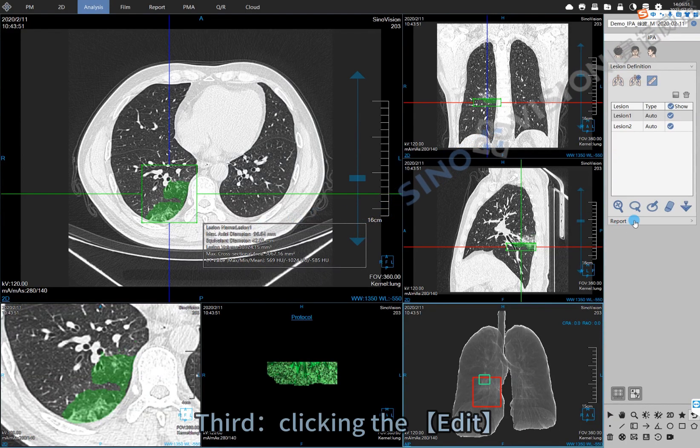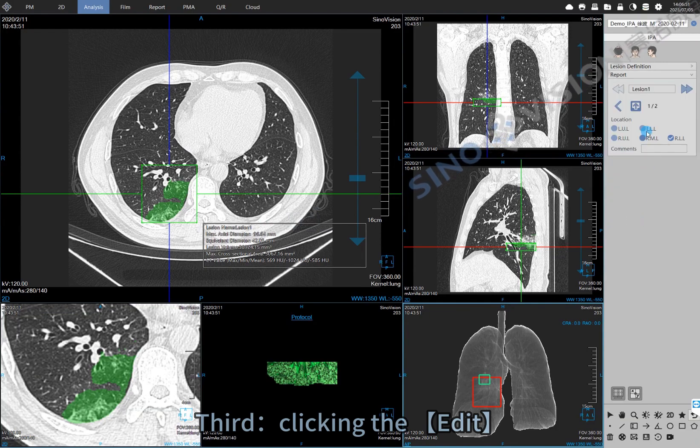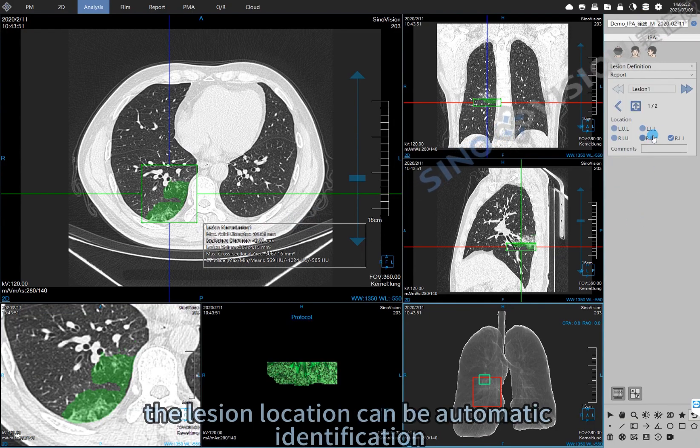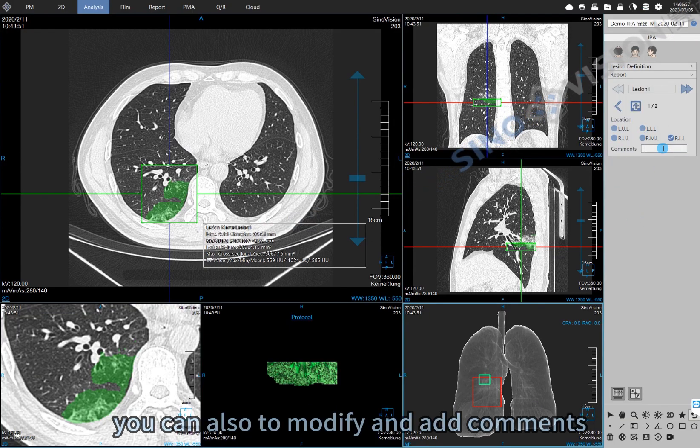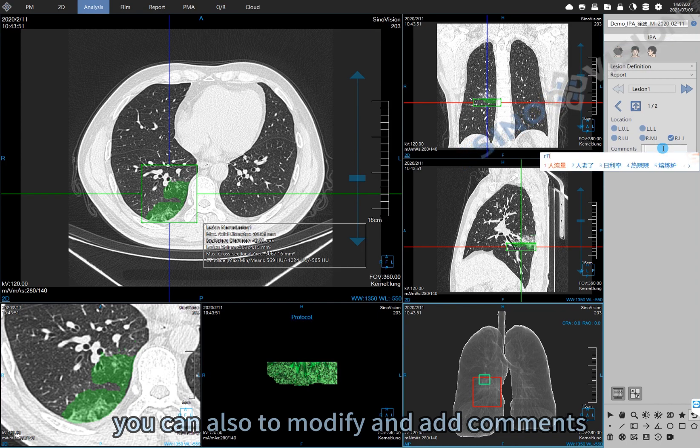Third, click Edit. The lesion location can be automatically identified. You can also modify and add comments.